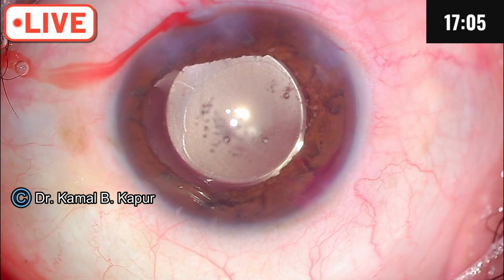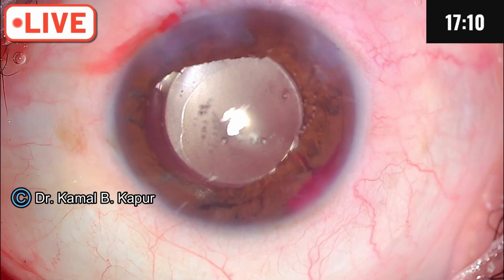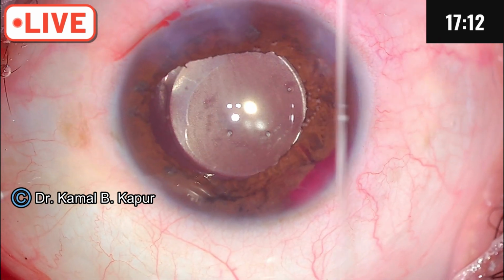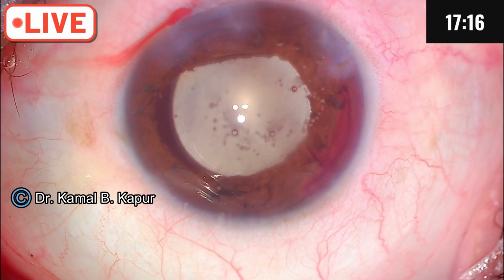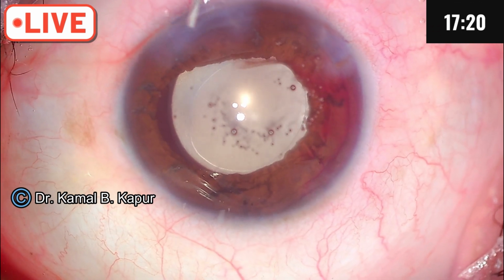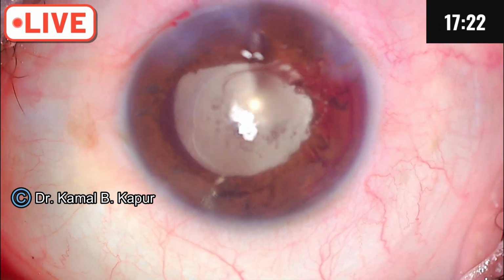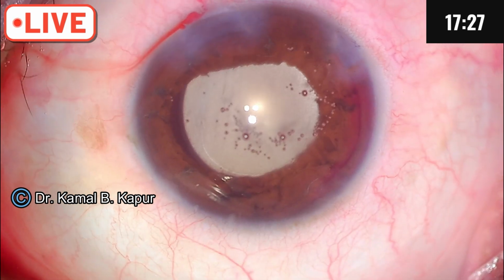So there you are. Surgery is gone off perfectly. Even though there is some small amount of oozing there, so we are lucky, we are safe that this will clear down by tomorrow. That's due to the manipulation of the iris when I was trying to push it back.